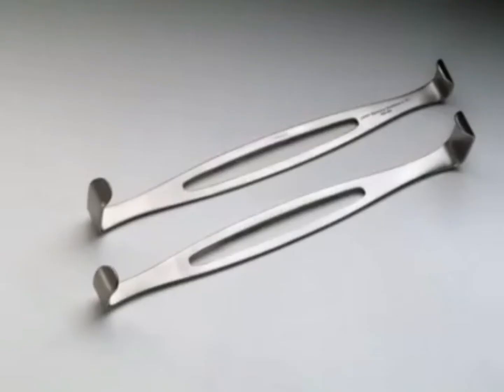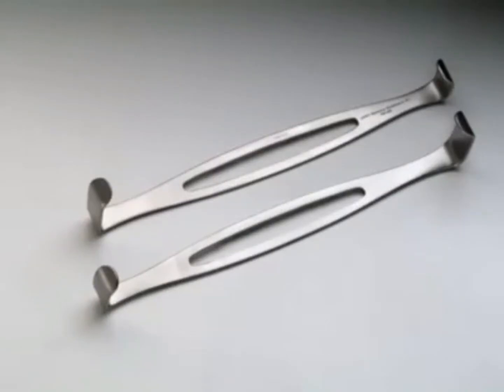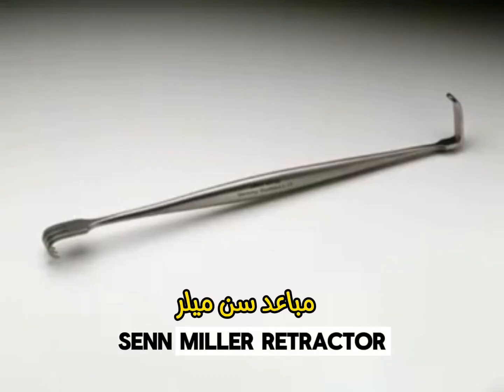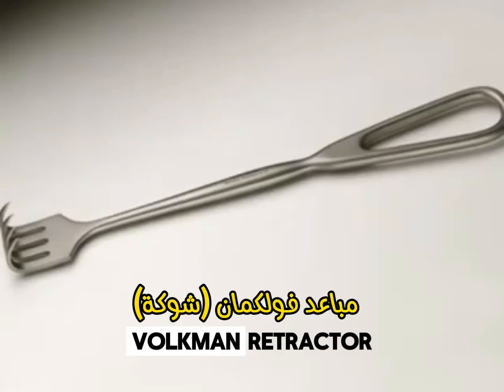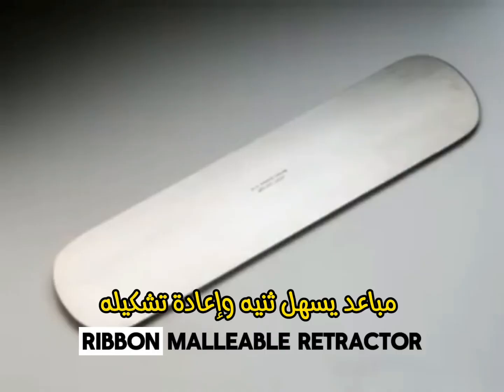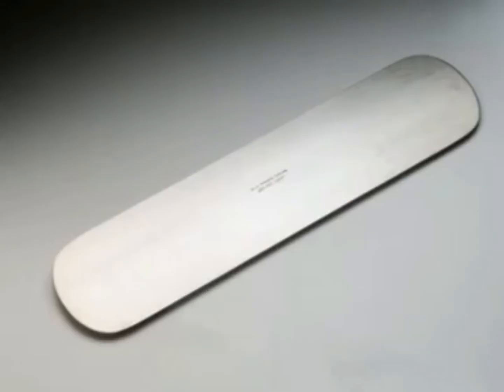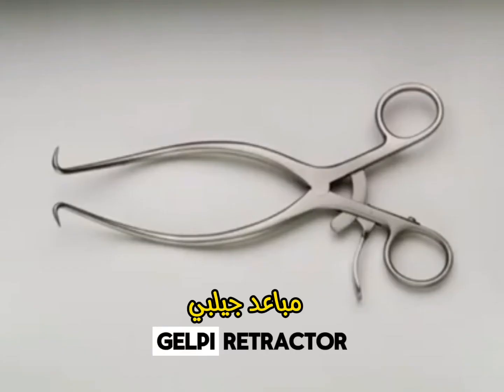Coker Forceps. Army Navy Retractor. Sen Retractor. Volkman Retractor. Ribbon Retractor. Wheatlaner Retractor.